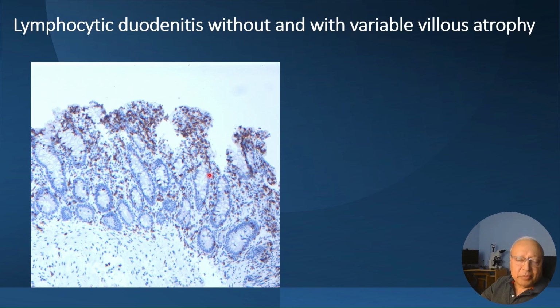And some pathologists choose to routinely do a CD3 immunostain that highlights the T lymphocytes, which are the intraepithelial lymphocytes, so that they can easily appreciate how they are elevated. Now, with experience, many pathologists are comfortable with that finding and choose not to do the immunostain, but that is completely up to the pathologist.